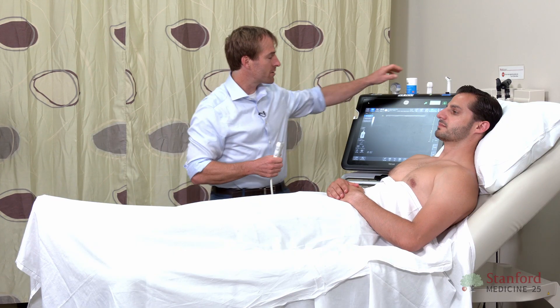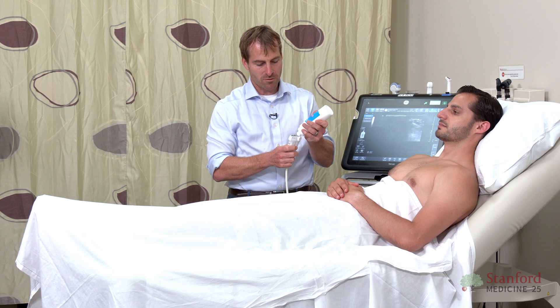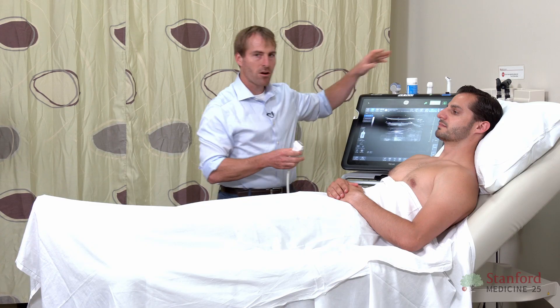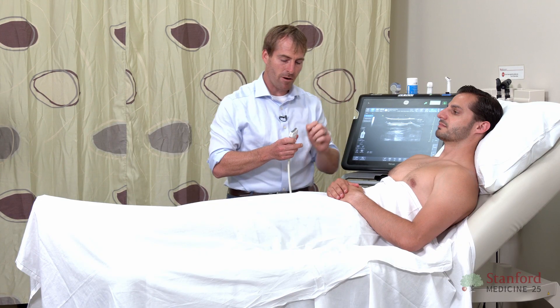Some of you may have already done this when you place a central line, so it's going to be a really similar type of exam in terms of what you need to visualize. Today we want to see where the neck veins collapse. We're going to be looking just as if we were measuring the height of the JVP visually, except now I'm going to use the ultrasound to visualize the vein. What I'm looking for is when the vein goes from being wide to where it comes together.